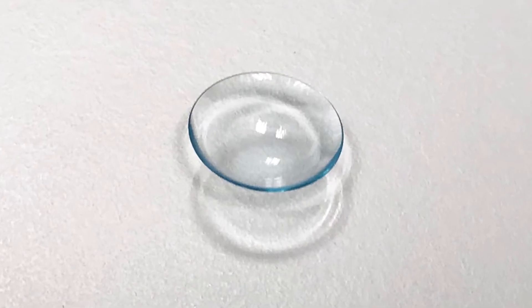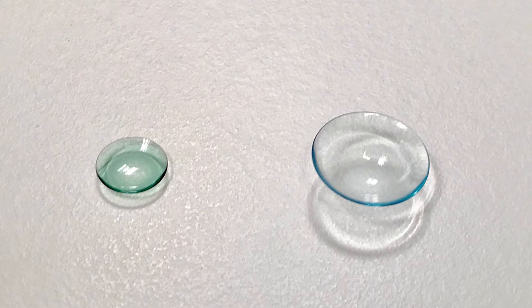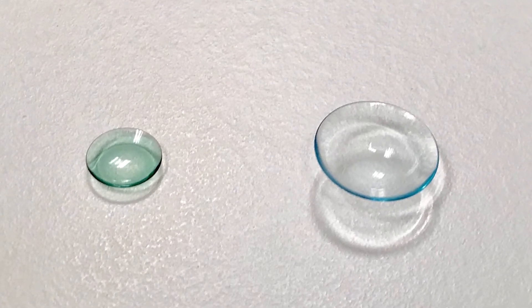Scleral contacts are large bowl-shaped hard contact lenses that range in size typically from about 15 millimeters to 18 millimeters in diameter. Unlike standard hard lenses, scleral lenses rest on the white part of your eye and vault over your cornea. By resting on the white part of the eye instead of the highly sensitive cornea, they're actually quite comfortable.